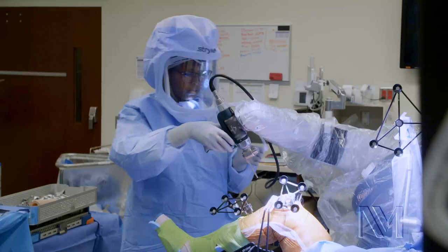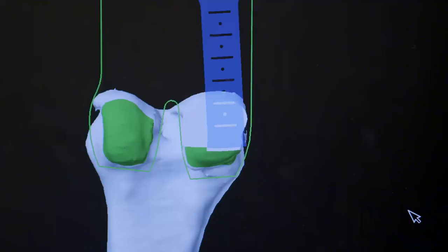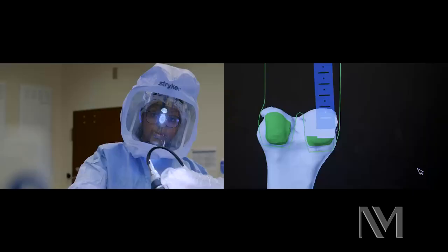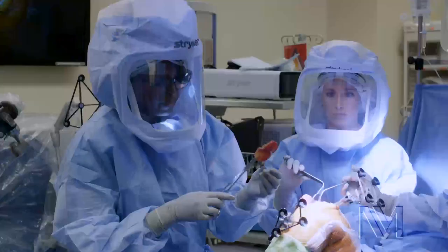We're now going to go on to the femur. And you can see as the green starts to disappear on the screen, that means that bone is being removed. This is our tibial cut — again, I'm not cutting the entire knee out. This is about seven millimeters total.